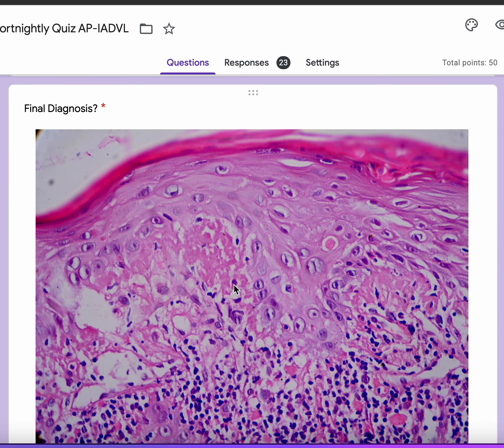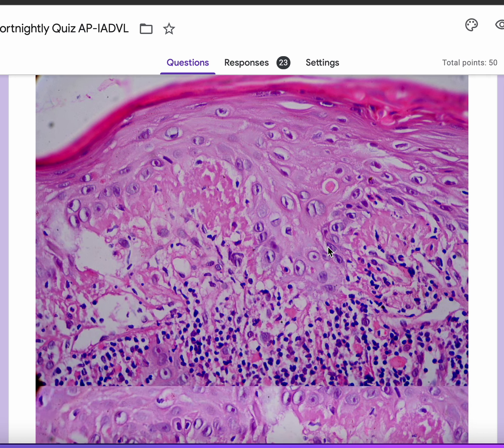So what does the higher power show? Higher power images show this is an area of epidermal thinning, and you can see these nice colloid bodies — it can't get more beautiful than this. You can see nice colloid bodies both in the epidermis and dropping down into the papillary dermis, and you can see this island of keratinocytes which has been cut off from the epithelium after it has been saw-toothed out.